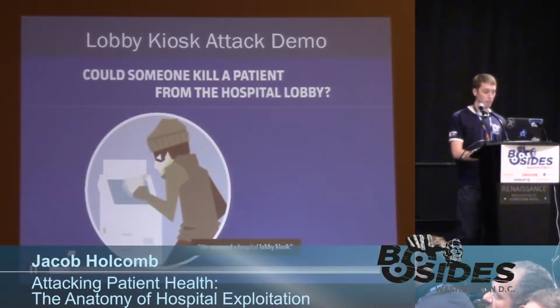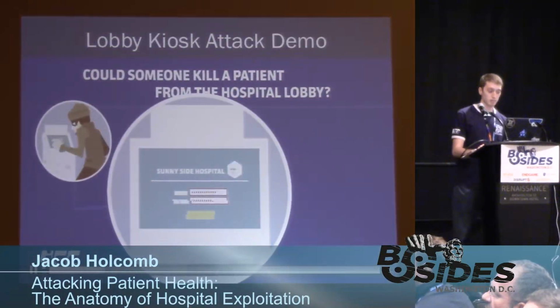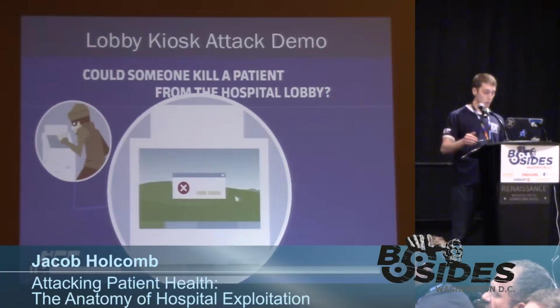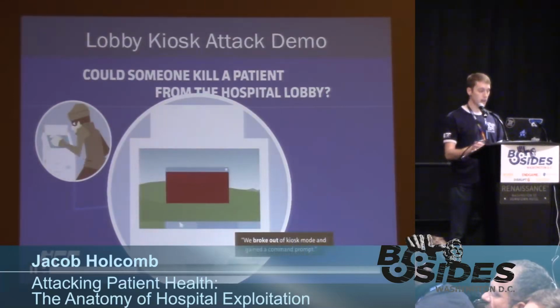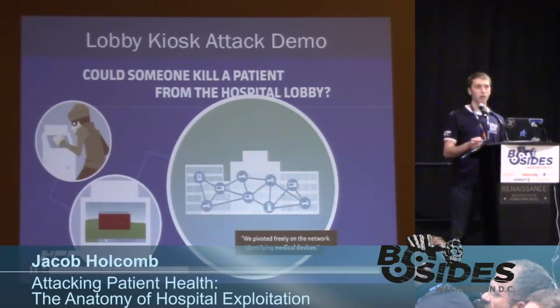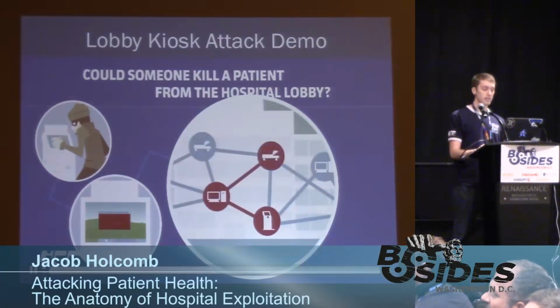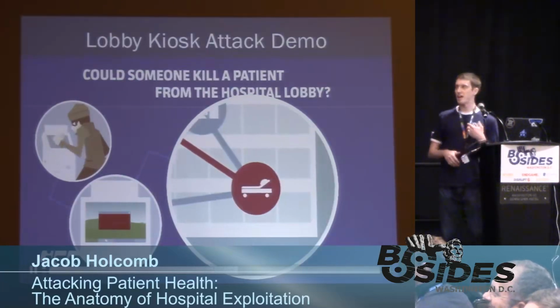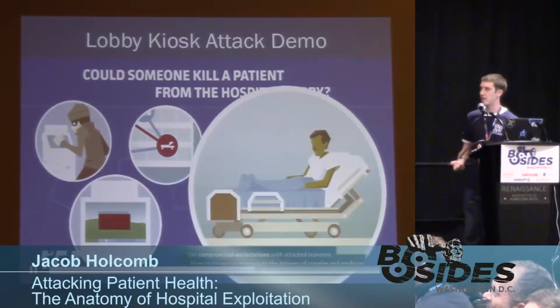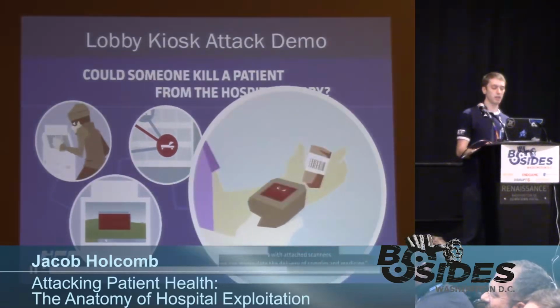So could somebody kill a patient from a hospital lobby? Well, the answer is yes. Just recapping what we did, we broke out of the kiosk mode and got a command prompt. From the command prompt, we were able to download code, and from there pivot throughout the network. Waiting on the video. And then as we pivoted through the network, we identified devices, compromised the devices, and then you're ultimately able to harm a patient.